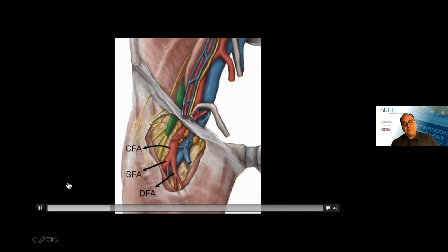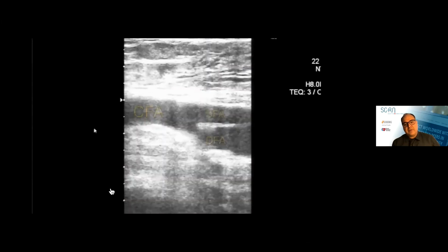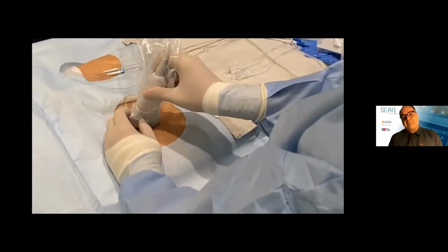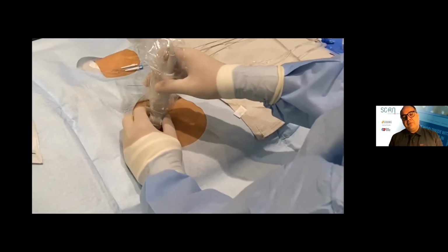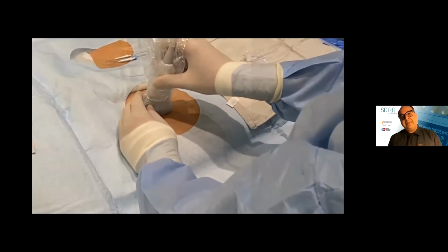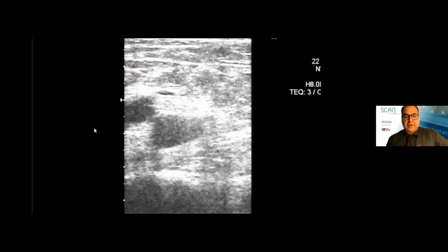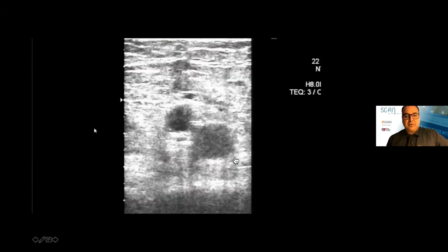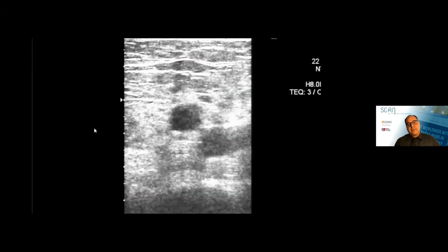Yes. We can rotate the head of the ultrasound and look longitudinally at the artery, and look at the bifurcation of the common femoral artery and femoral vein. This requires moving the probe 90 degrees several times back and forth to find the appropriate level that puts the puncture site just above the bifurcation. This corresponds to the head of the femur when we're using fluoroscopy. As you saw the bifurcation, we moved the probe upward towards the patient's head. And now you will see the micropuncture accessing and puncturing the femoral vein right about there.